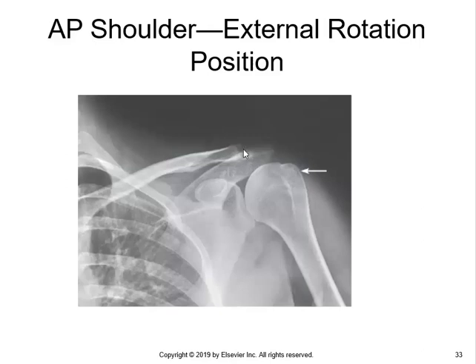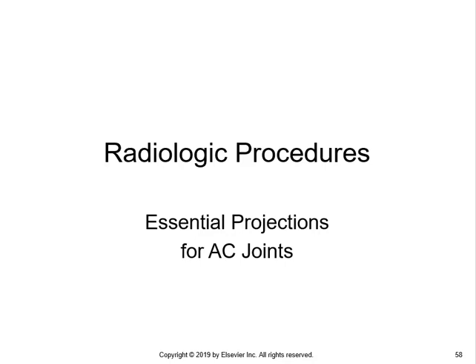The AC joint is this dark line right there. So it's a fibrous joint space that permits some motion, but it's not like a diarthrotic joint space that permits free motion like what the ball and socket joints allow. So separation of those two is very painful, and it disrupts that fibrous connection between the two.